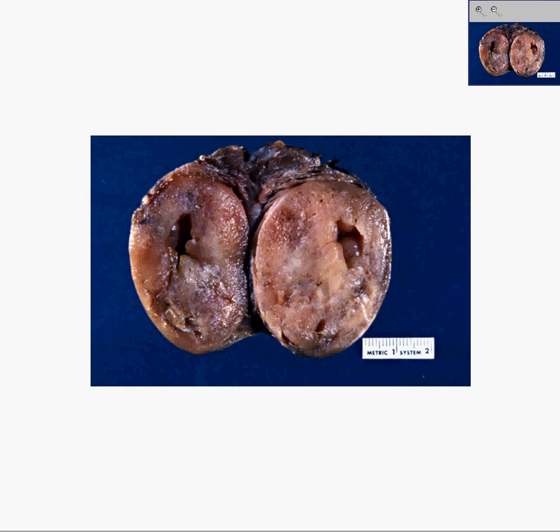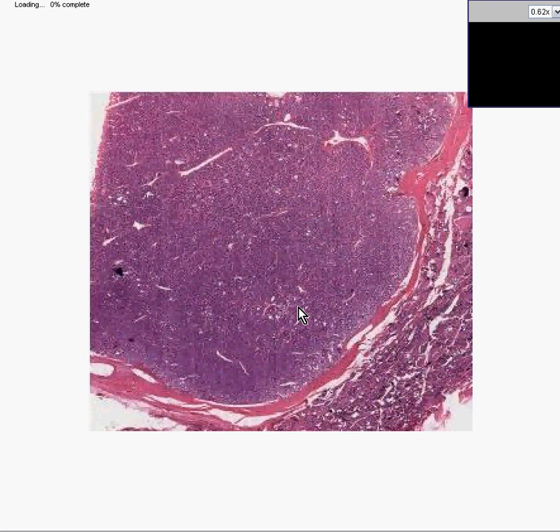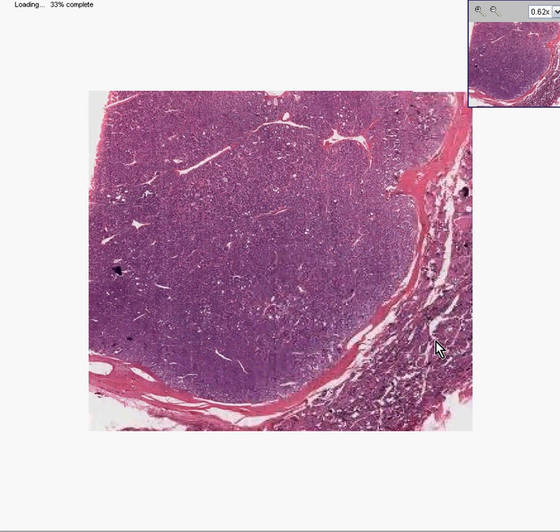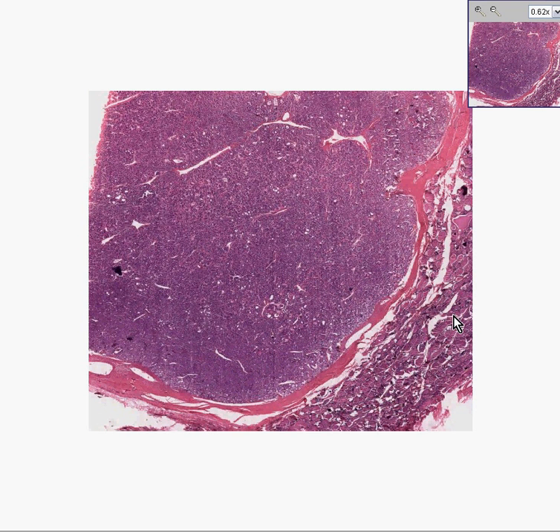Let's look at the tumor microscopically now. Here is the normal surrounding thyroid follicles. Here is a very nice sharp capsule separating this tumor from the thyroid, and all of this is the tumor.